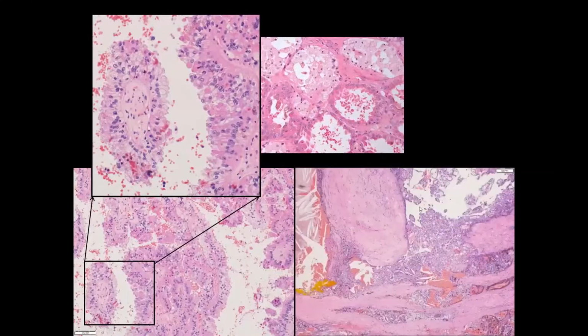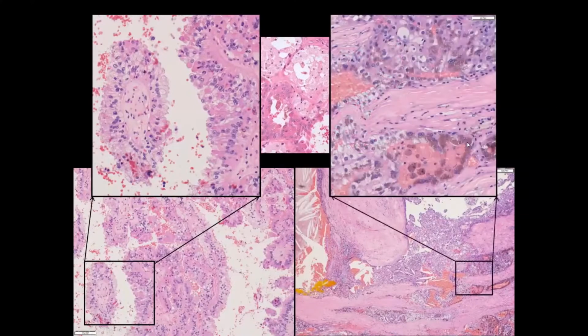And then what I mean by this degenerative change is exactly this. So you see areas of fibrosis, hyalinization, and degenerative type necrosis with cholesterol crystals, some bilirubin pigment. And you also have areas where there is clear-cut hemosiderin within the tumor cells. So this kind of heterogeneous feature, this kind of degenerative phenomenon, is usually not associated with syndromic tumors. These are actually just papillary renal cell carcinomas that have some of these type 2 like features.